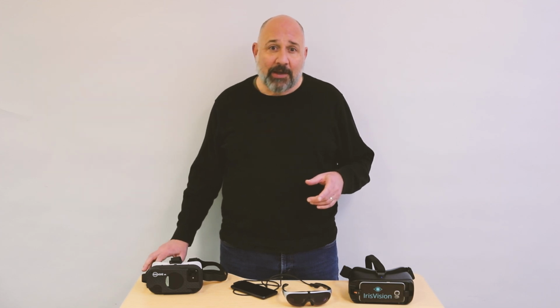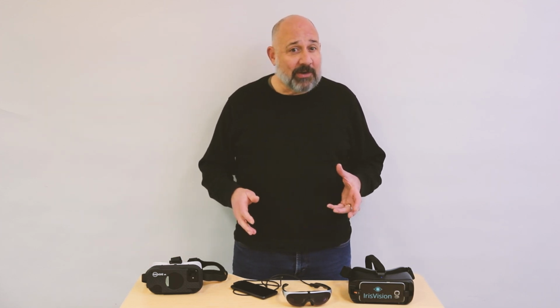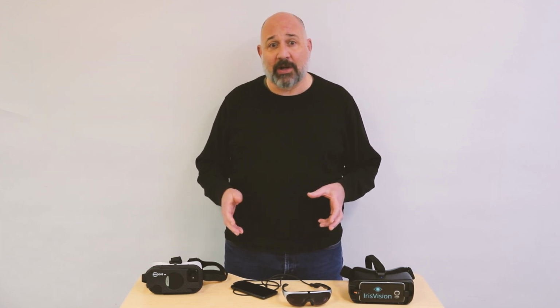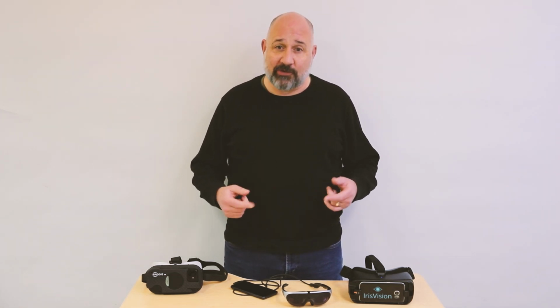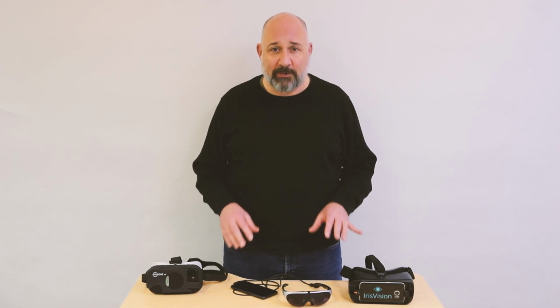Now that said, if someone's in the early stages and they've gotten treatment to halt the progression, it quite possibly would work. But if I had macular degeneration and it was still progressing, I wouldn't consider this to be a good option because it might work to begin with, but over time it might let you down.